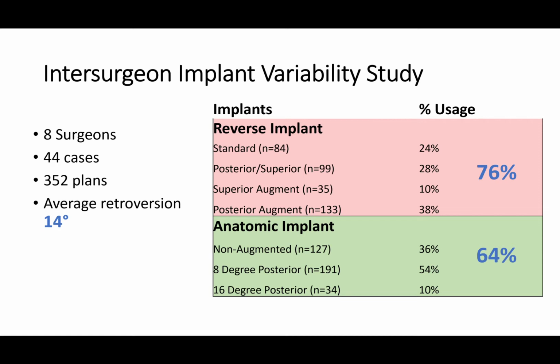What this indicates is that when you can more accurately quantify glenoid wear and plan a specific degree of correction that optimizes loading mechanics, implant fixation, and bone preservation, augments are used more than half the time. Without planning and navigation, our historical records showed that we used them in only 15 to 20% of non-navigated cases, which means that these cases were likely either left in residual retroversion or required greater subchondral bone removal during corrective reaming.